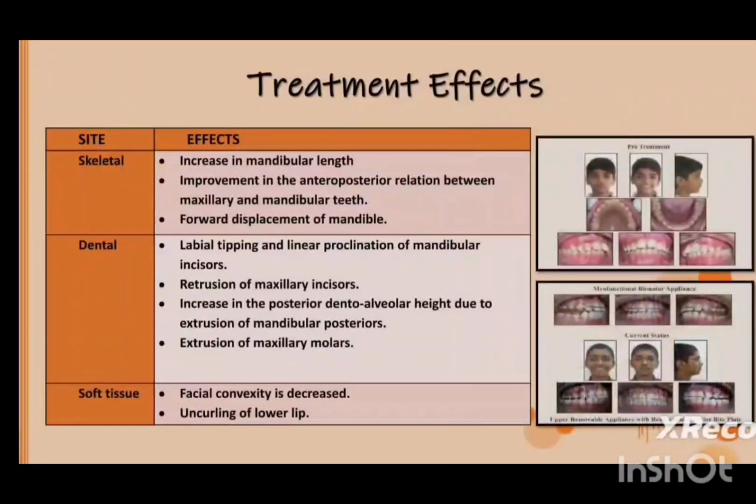Now coming to the treatment effects, the skeletal effects include the increase in the mandibular length, improvement in the antero-posterior relation between the maxillary and the mandibular teeth, and the forward displacement of the mandible, which was the primary goal.